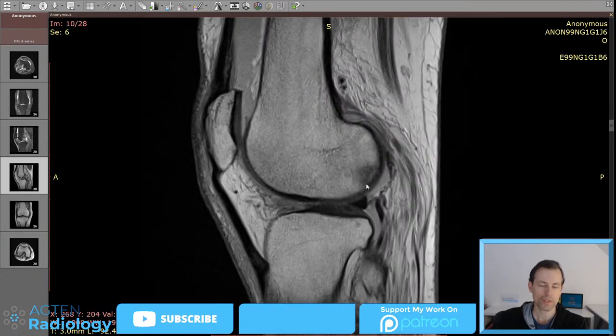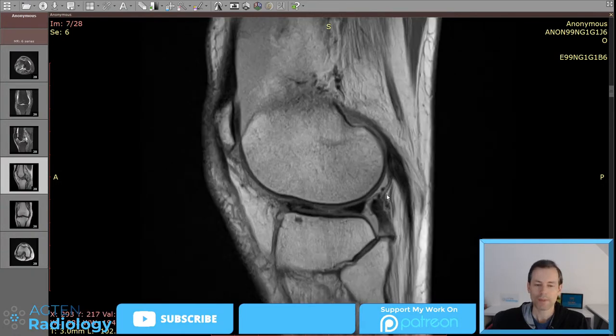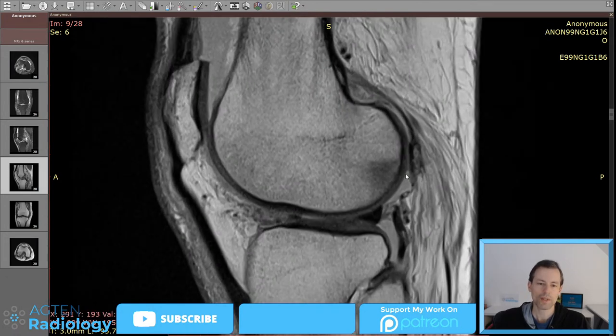And this is also part of this. I think if you think about the trabecular grid, it's not impacted, but it's just deteriorated. And potentially there is already some healing process going on, that we have tiny bits of callus formation already. I'm not really sure about the time delay. What was the time delay? 6 weeks. So if that happened 6 weeks ago, technically we could expect maybe already some healing processes. So that's the reason. If the cartilage looks really nice and smooth, I don't think we should use osteochondral lesion, because osteochondral lesion is just a descriptive term if we have damage to bone and cartilage, and here we don't actually have cartilage damage.